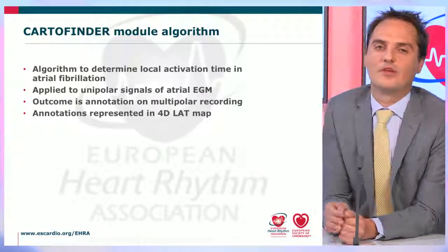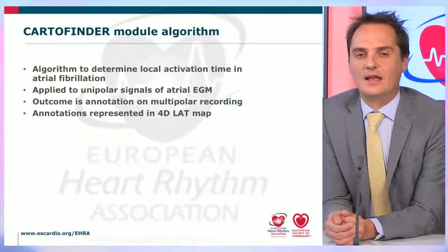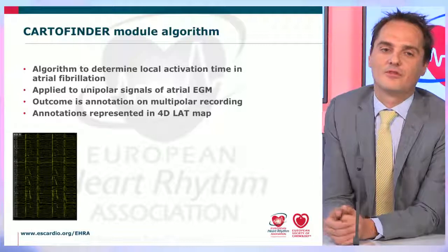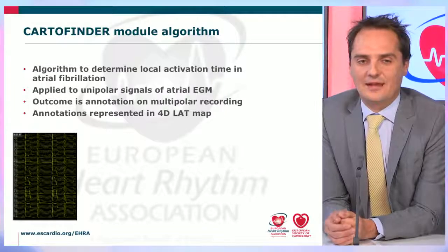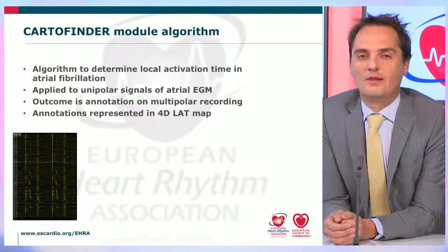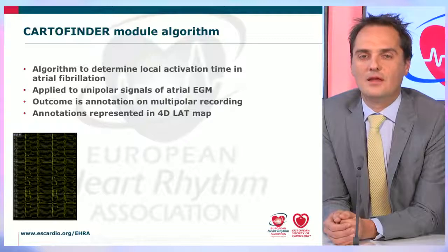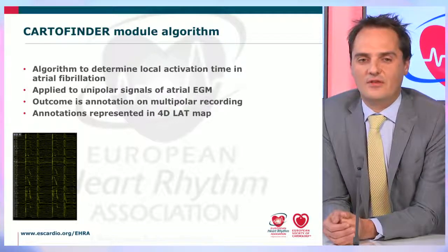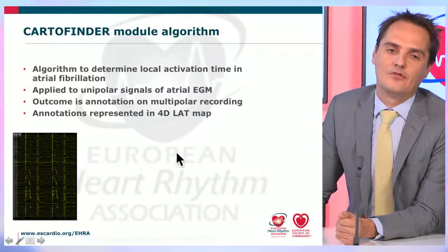And once you have this, you can represent this, of course, visually in what is called a 4D LAT map, 4D because the time component is integrated. How this looks visually is like this. You start, of course, with raw data, with recordings, and from this raw data, I think you immediately appreciate that a purely visual appreciation of these signals is going to be hard simply due to the fact that there is an overwhelming amount of data present once you start collecting these recordings.